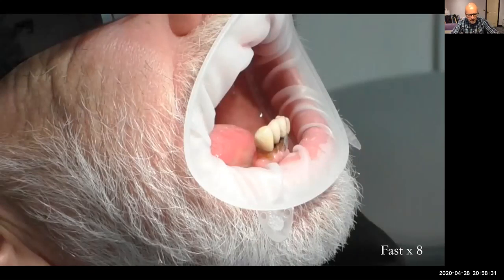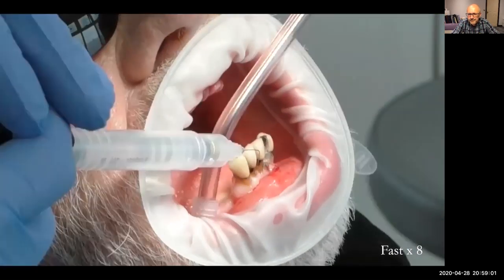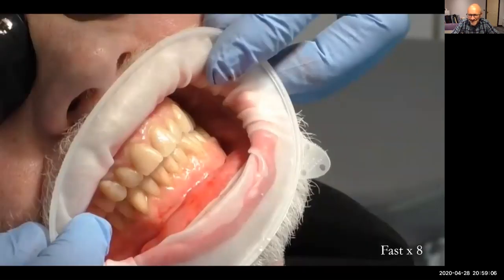So I want to share with you now Bert. You may have seen Bert in the past in some of the videos, but I now want to share with you exactly how I made a lower denture fit beautifully. So I'm going to take out Bert's lower five front teeth there. They've got periodontal disease and also caries, and they need to come out. This is speeded up. So I inject, freeze him up all the way around, get the teeth out super fast, and fit the full lower and full upper.